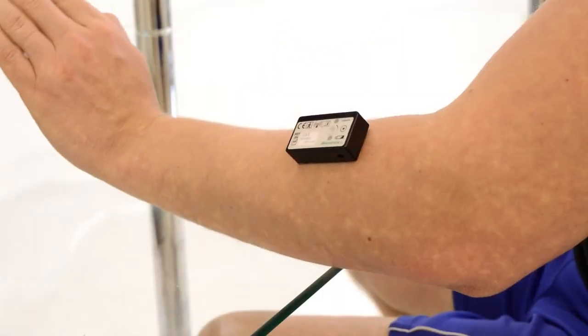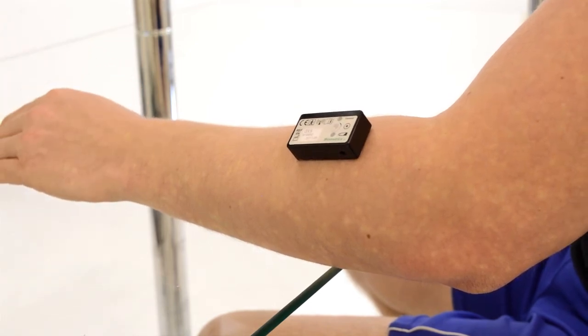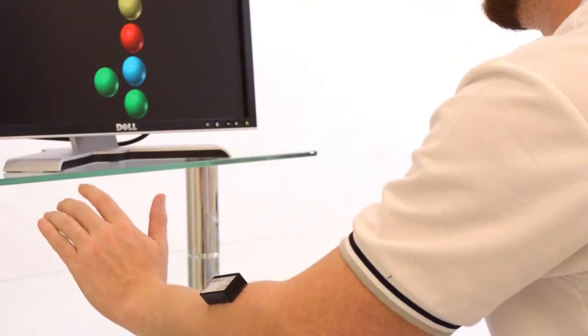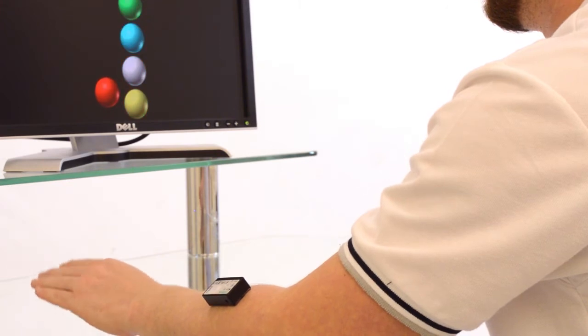As a muscle contracts, the MyoX sensor uses the electrical activity that is generated to control the movement of objects in gradeable E-Link activities, facilitating exercise. The greatest benefit of MyoX is that it can be used in early rehabilitation as soon as there is the smallest flicker of voluntary muscle control, even when there is no visible joint movement.